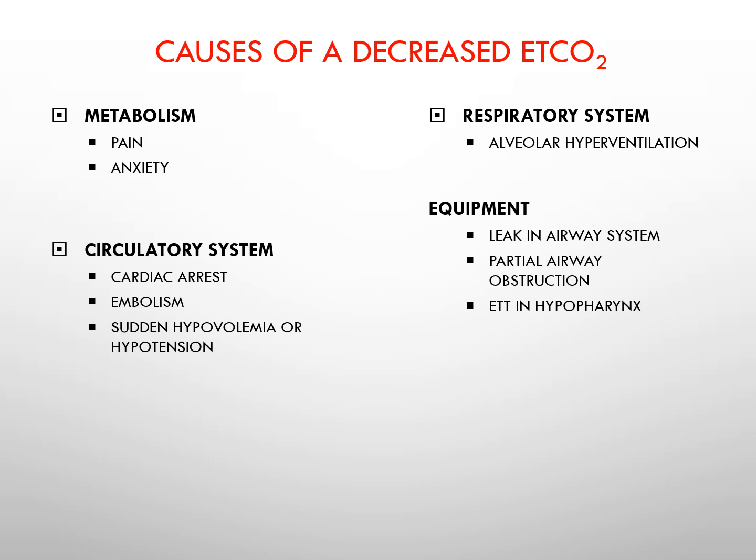With an embolism or blood clot, the heart may be functioning okay, but there's a blockage. There's some sort of blood clot that's preventing the oxygenated blood from getting to the tissue, and the venous blood that has CO2 from getting back to the lungs to be exhaled. Sudden hypovolemia or hypotension, whether it's due to blood loss or some other cause like septic shock, can also cause a decrease in end-tidal CO2.